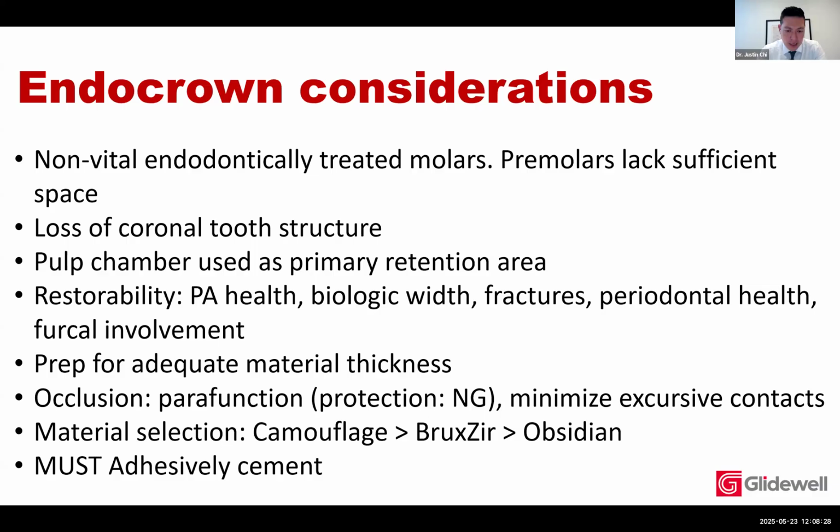According to the literature, a lot of endo crowns are treated primarily with lithium disilicate, so EMAX type restorations, where the obsidian is in that category as a glass ceramic. It has really reliable, repeatable bonding protocols. It is plenty strong. You got a tremendous material thickness in the majority of that restoration with these endo restorations. But some areas of concern and where failures do happen are when maybe occlusal excursive contacts are not really taken into consideration, or certainly where the material thickness is compromised.